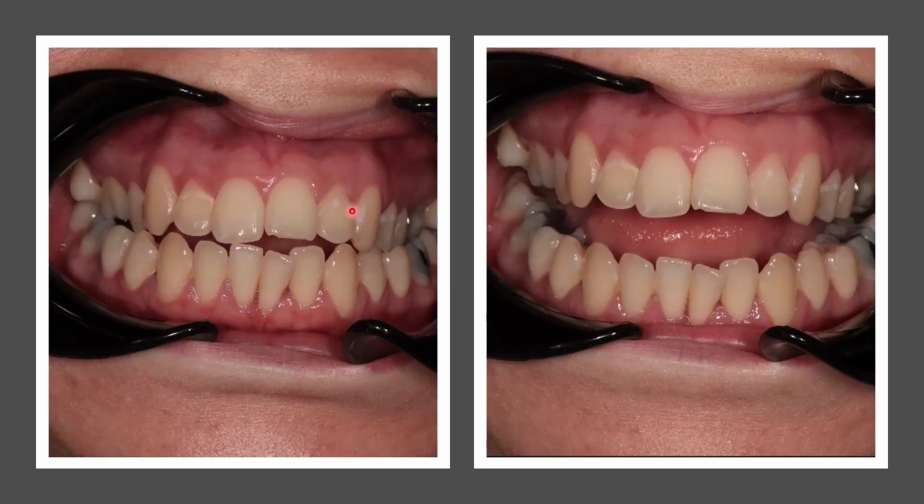We could have a look at an alignment plan that just looked at those front 8 teeth. So we've got the upper 2 to 2, lower 2 to 2. And we can say, is there an alignment plan in here that might give us an improvement on the smile here? We're probably never going to make it perfect. And so that's an opportunity there where we've got quite a complex case, but we might be able to do something simple to just give us an improvement.